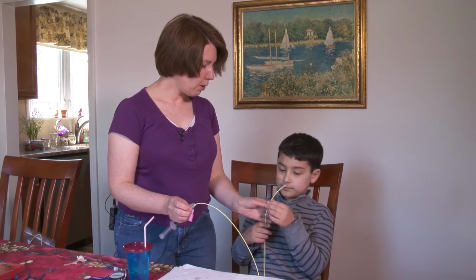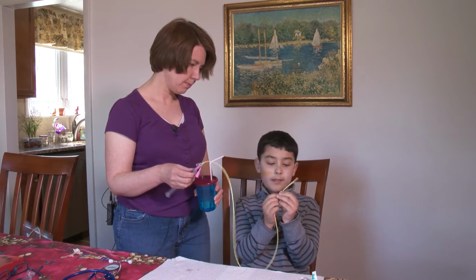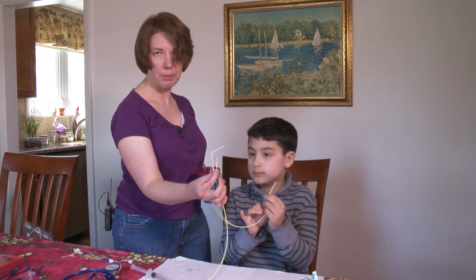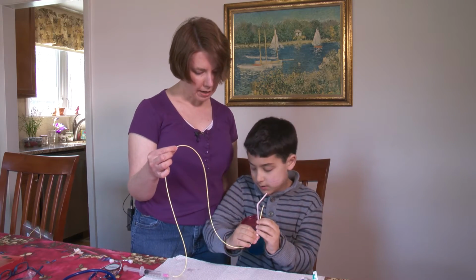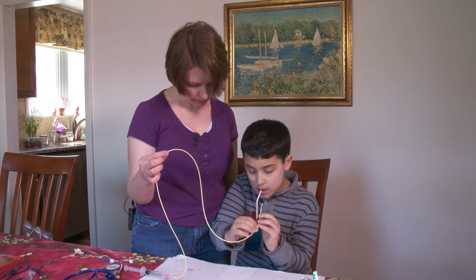Yes. So Noah holds the tube with two hands. I like to hold it right here on this dot and up here, this line. And then I hold where the mark is that we put so that he knows when to stop. So I know where to stop and I can't go any farther. That's right. And then I hold his glass of water handy for him so that he can sip the water while he's putting it in.